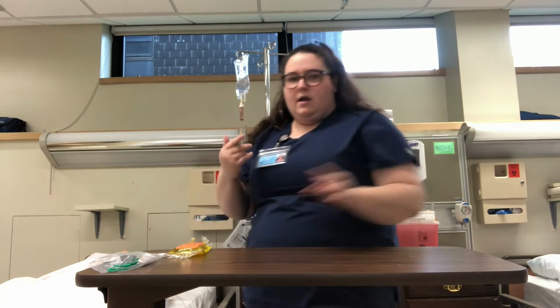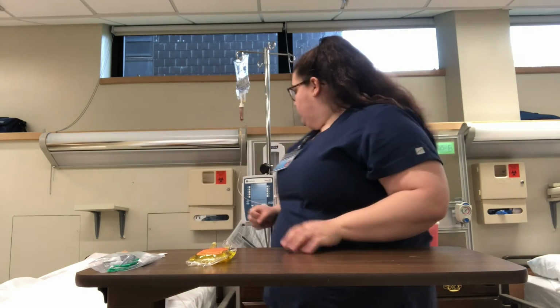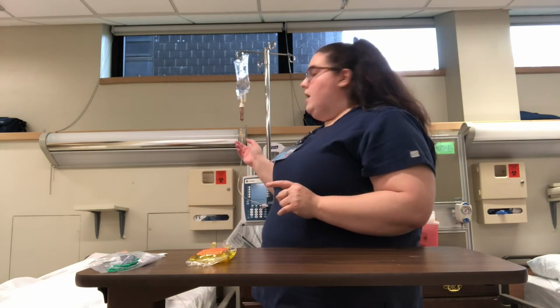Before I came into the patient's room, I verified the primary IV order and the IV piggyback order against the MAR. I checked for appropriateness and clarified any inconsistencies, and I also checked the patient's chart for their allergies. I have all my supplies here. I'm gonna wash my hands, and I'm going to compare the IV piggyback med to the MAR for my second check. And I also checked the compatibility with the already primary infusing medication, which is running at 25 mLs per hour. The tubing on the primary line is only 24 hours old, so it's okay to use.